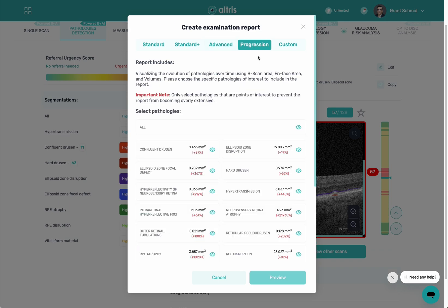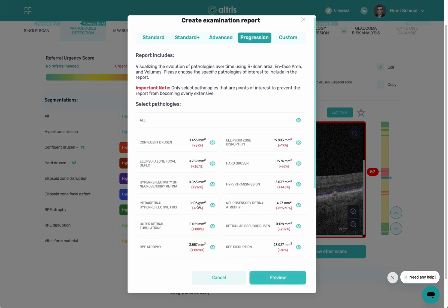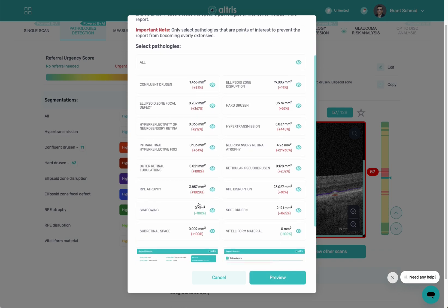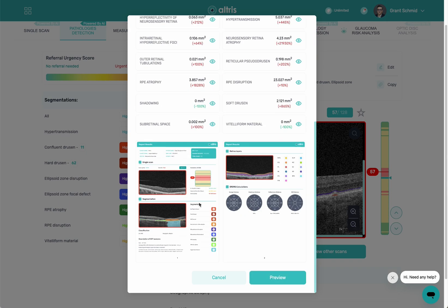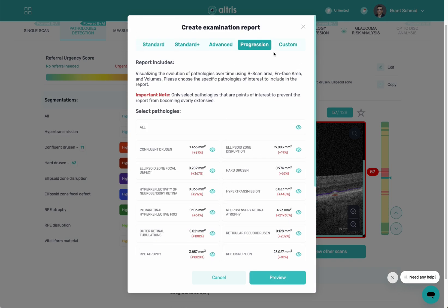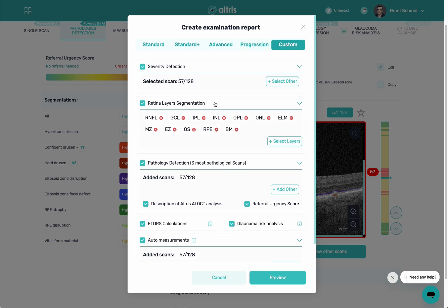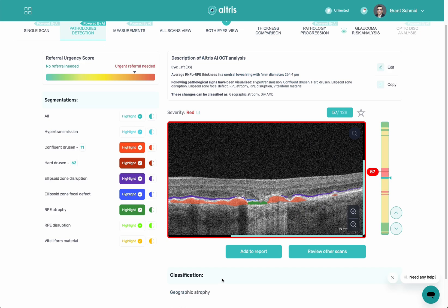You have the ability to do a progression report showing change. We also have custom reports that you can generate on your own by picking different parameters. So if I wanted to add just this view to a report, I would click here and it would go into the report system.